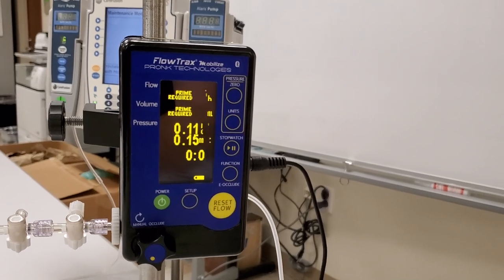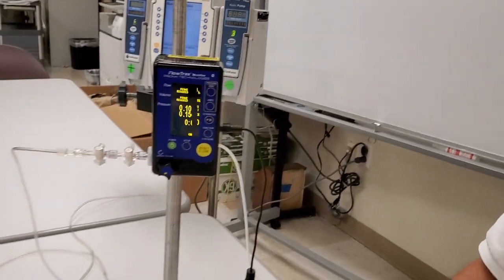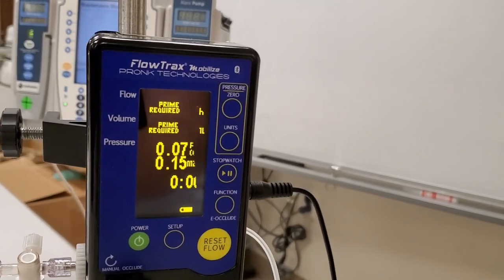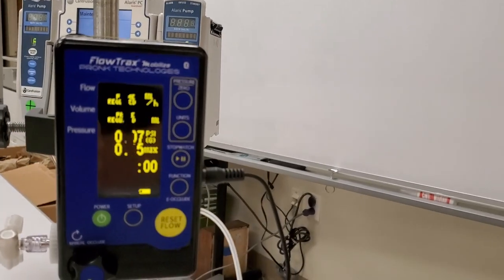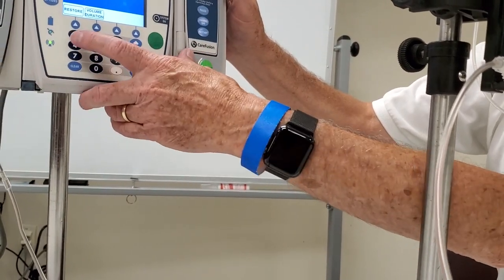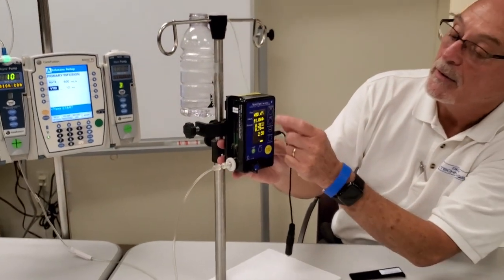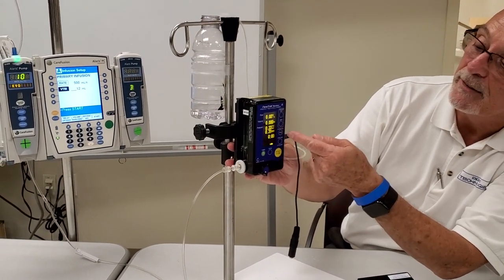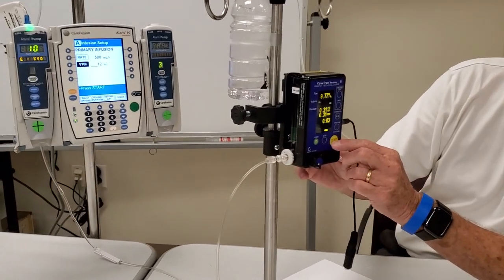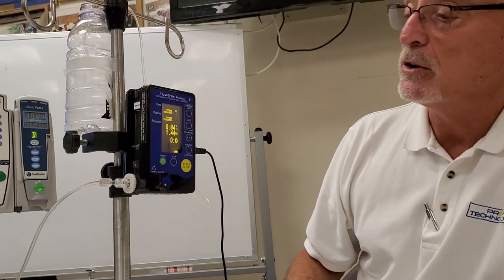The screen tells you everything you need to know. You may notice on camera it appears to flicker, but that's the refresh rate of the LCD panel — it's actually very crisp and clear in person. Notice it says 'Prime Required' on the display. In order to get numerics you have to prime it. Before starting, hit Reset Flow to set everything back to zero, and also zero the pressure.